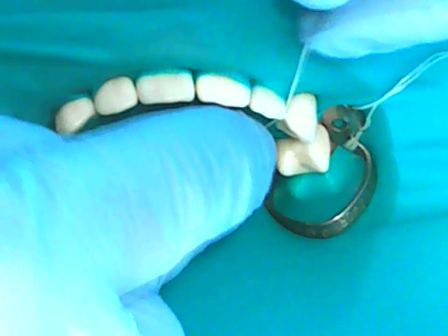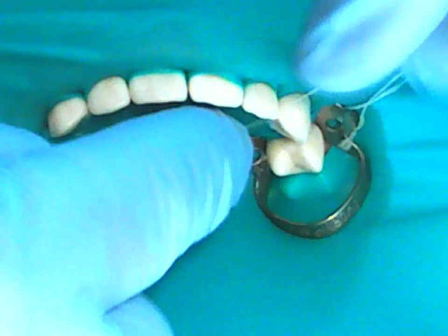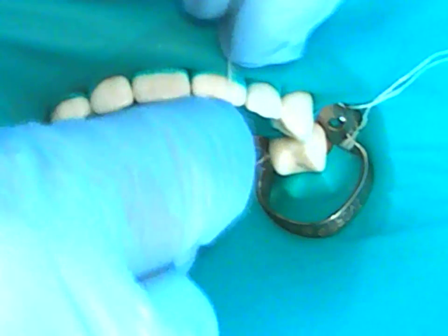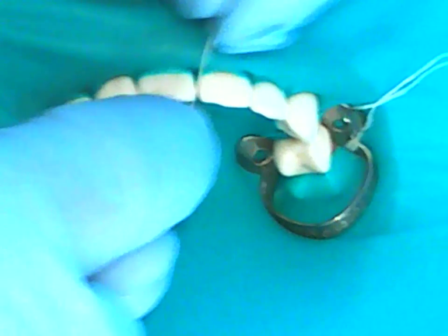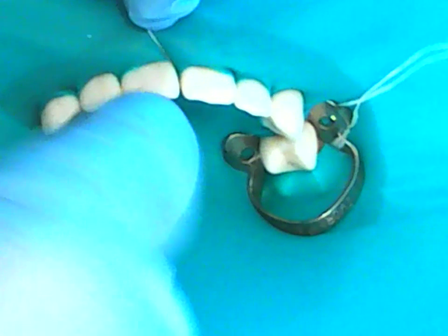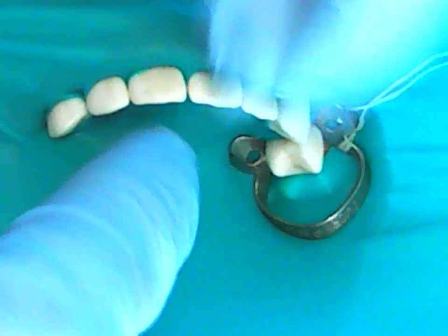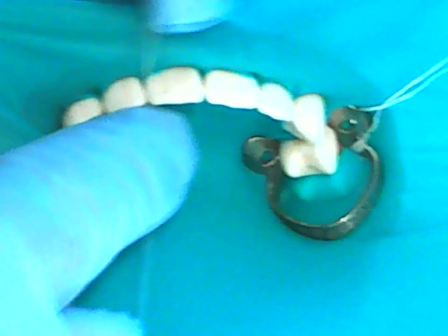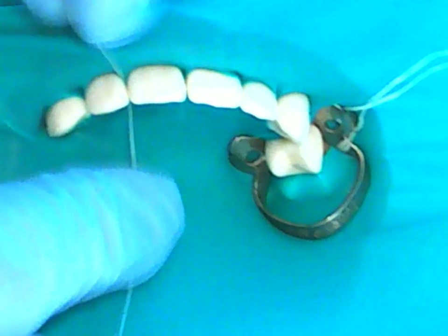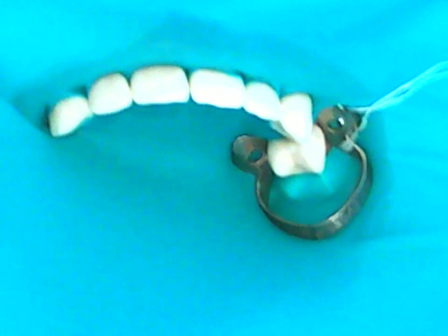Same thing as I continue on. So distal of the 2-2, mesial of the 2-3, and out the embrasure space. Continue on in that fashion throughout your exposed area. Many times we're looking at the facial and not thinking about the lingual, so make sure to make a nice C shape so that it goes down on both sides. Keeping client comfort in mind, we don't want to be pushing really hard into the tissue. We want to just be nicely, gently, in the sulcus and out the embrasure space.